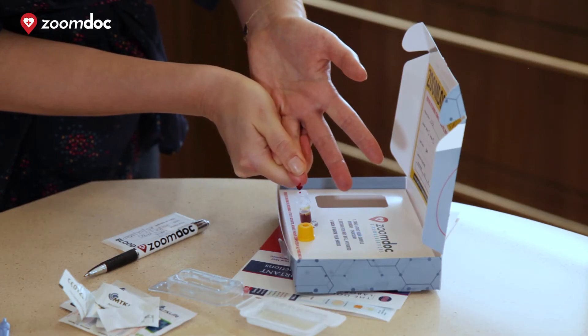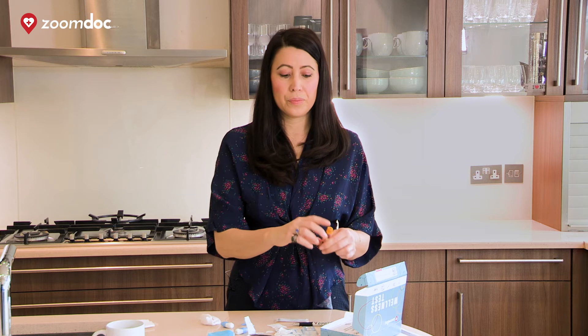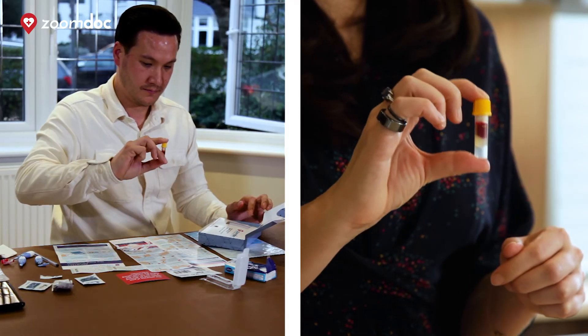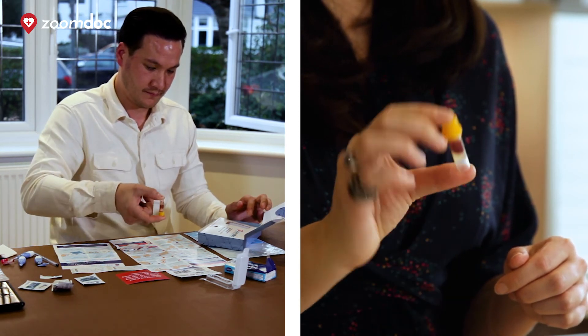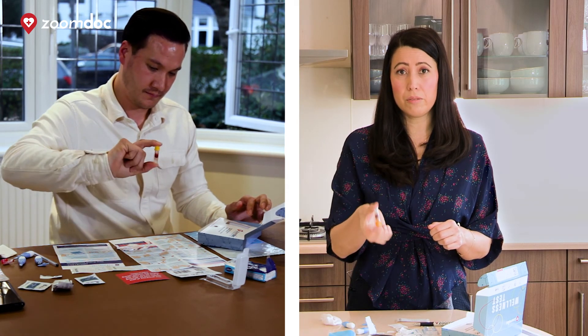Once you've filled the vial, grab your cotton pad and apply some pressure over the finger. Close the vial and you should hear a click so that it's securely on. Then take the vial and rotate it upside down five to ten times — this step is very important so that we can get an accurate result.